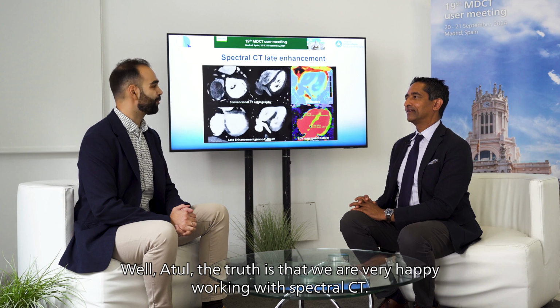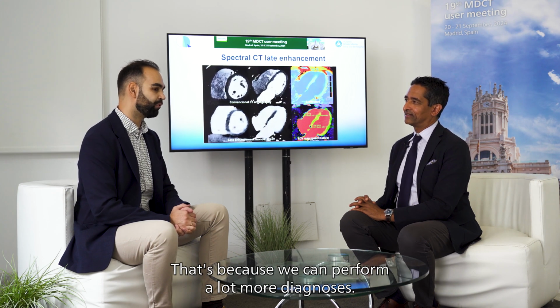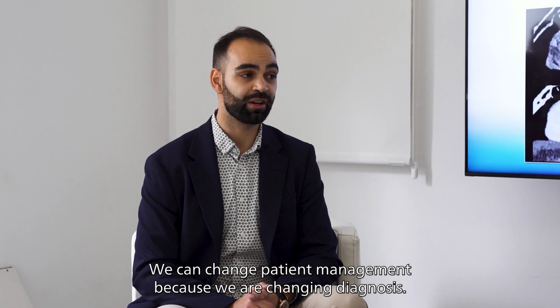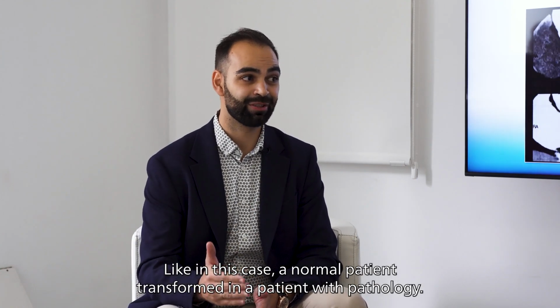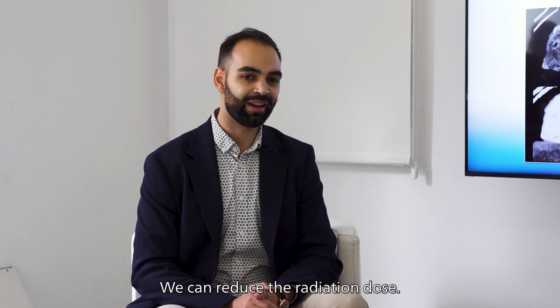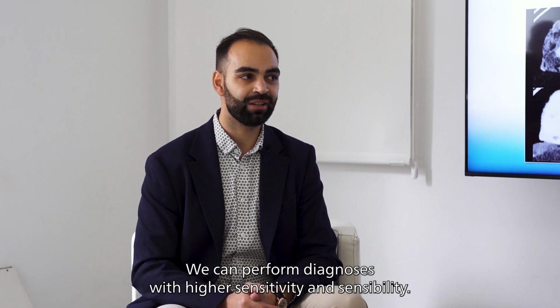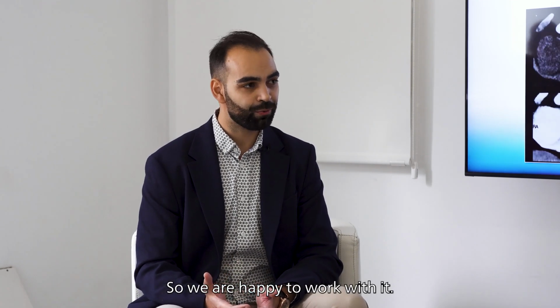Well, Atul, the truth is that we are very happy working with spectral CT. That's because we can perform a lot more diagnoses. We can change patient management because we are changing diagnosis, like in this case, a normal patient transformed into a patient with pathology. And we can save contrast, we can reduce radiation dose, we can save time for the patient, we can perform diagnosis with higher sensitivity and specificity. So we are happy to work with it.